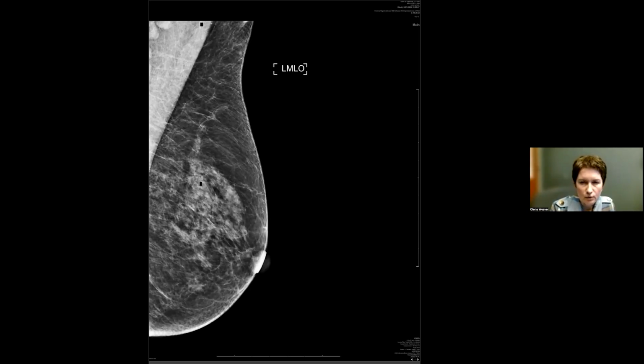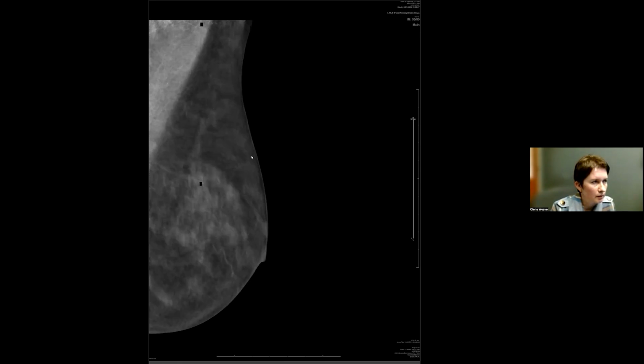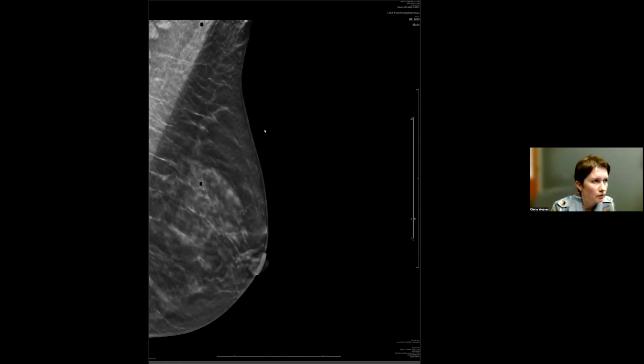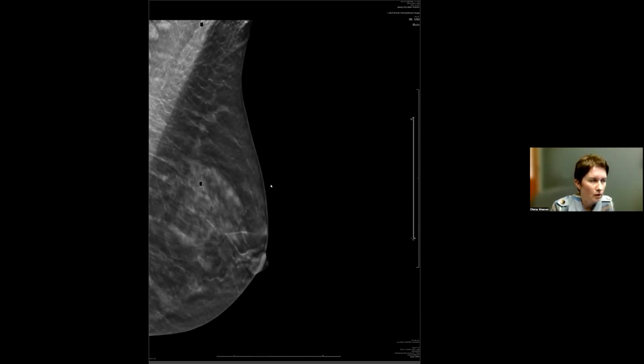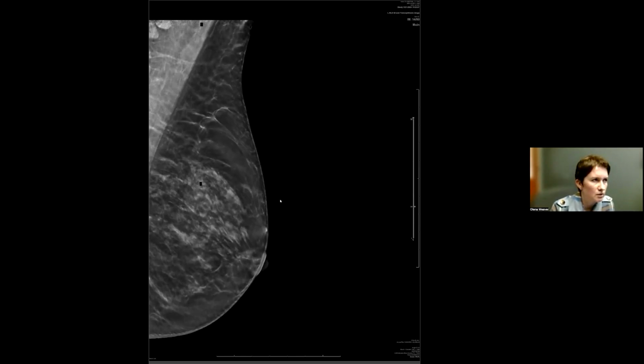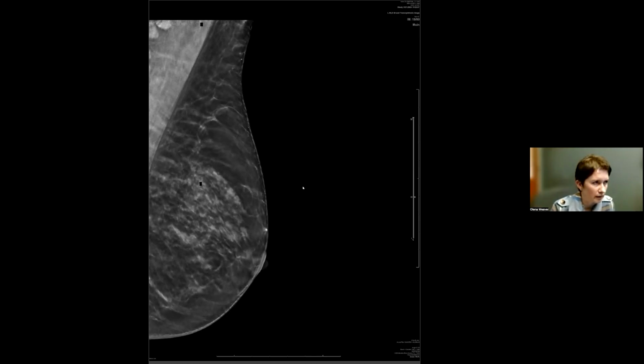In our case, we also had the benefit of digital breast tomosynthesis under the same compression, and just scrolling through the DBT images, there was nothing there at all. So in this case, this artifact was relatively easy to dismiss on those grounds. Sometimes it's not as easy, so you need to do additional images. And especially at the beginning, you may even end up doing some biopsies of that, but it happens.